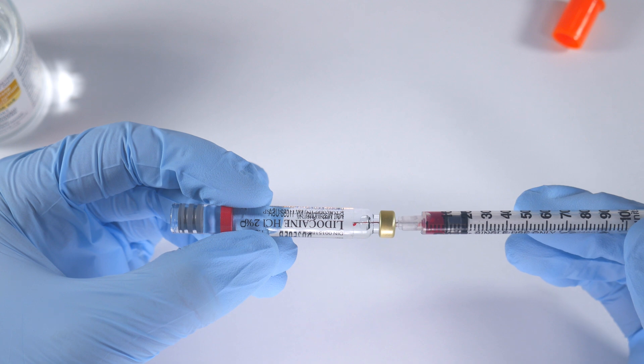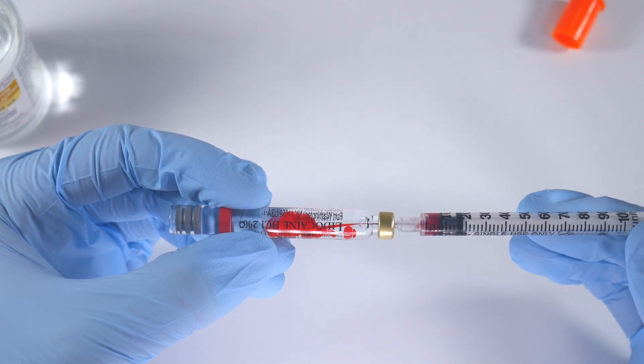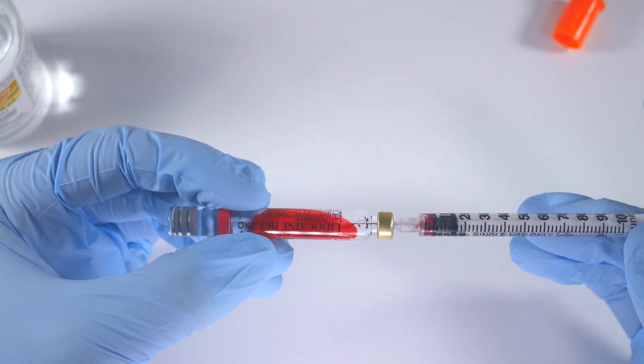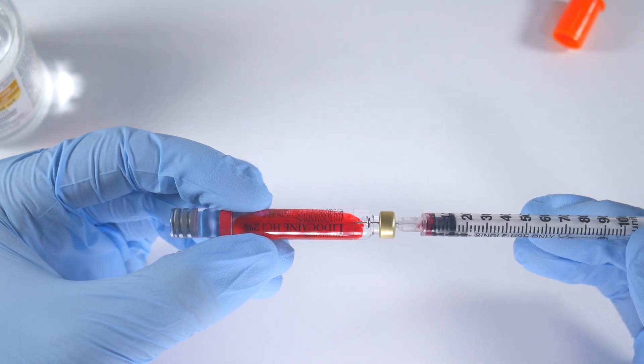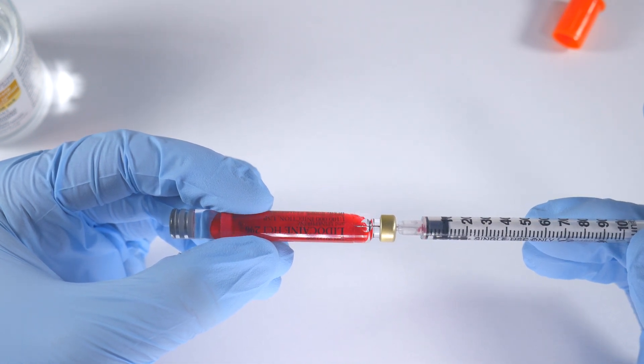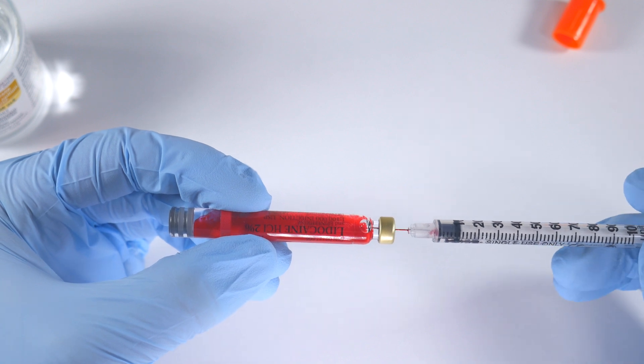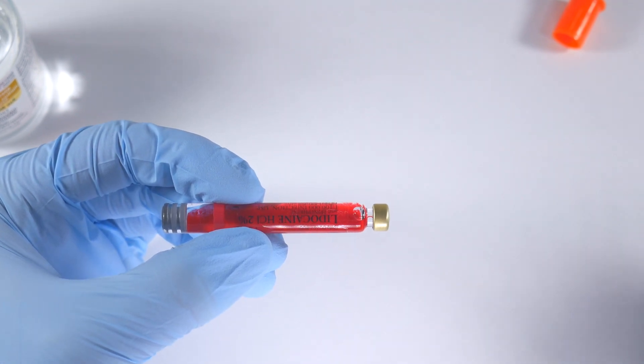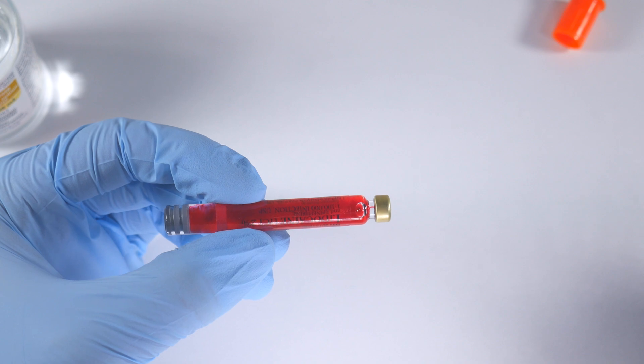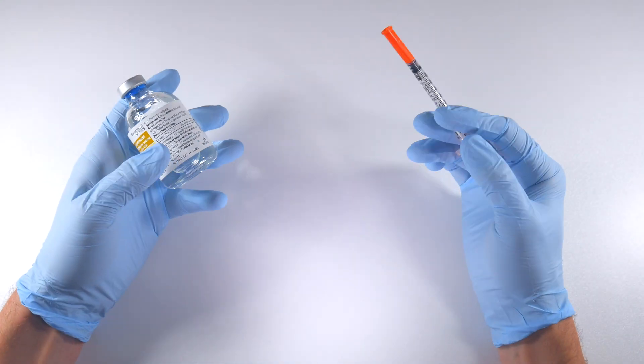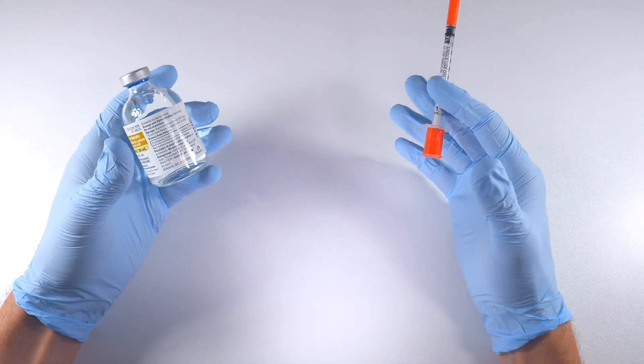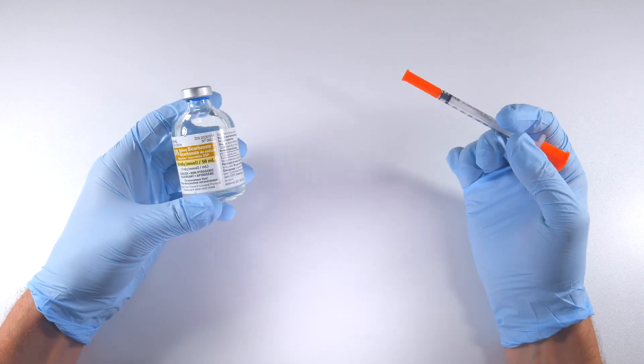So I'm going to inject this now. Oh no, you forgot to aspirate! No, we didn't, we're okay. So that's it. That is as simple as I can get. Basically I just demonstrated to you a way that you can quickly and effectively do this chairside and have great results.